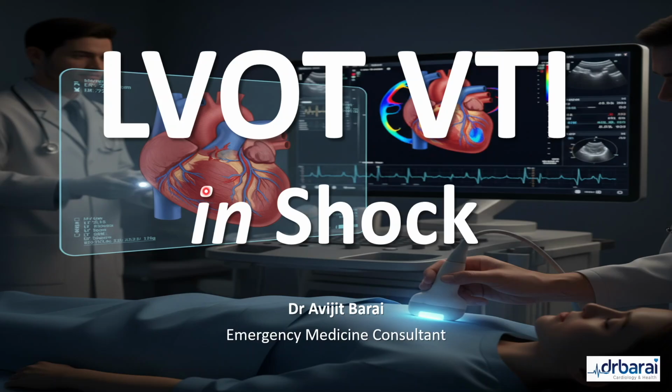Over the next half an hour or so, we are going to talk about LVOT VTI in shock. For those of you who have watched my previous videos on LVOT VTI, I'm pretty sure you have got some idea about the left ventricular outflow tract velocity time integral, or LVOT VTI. In this particular video, we are going to talk about the usefulness of LVOT VTI in shock patients.